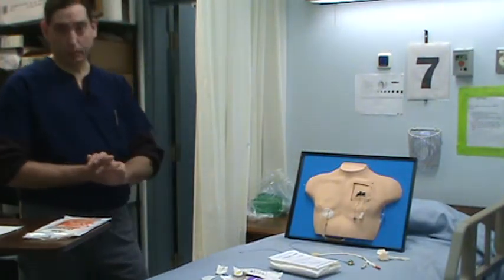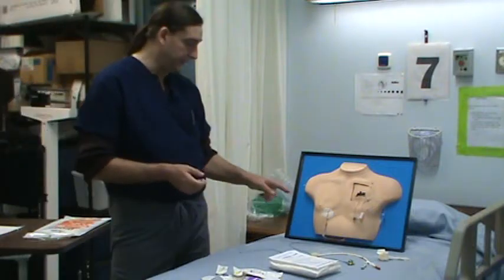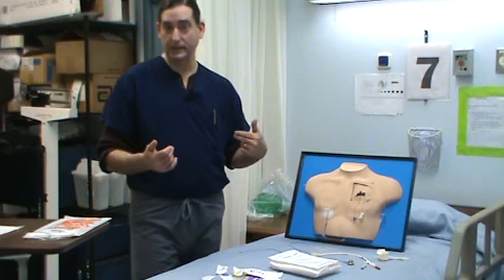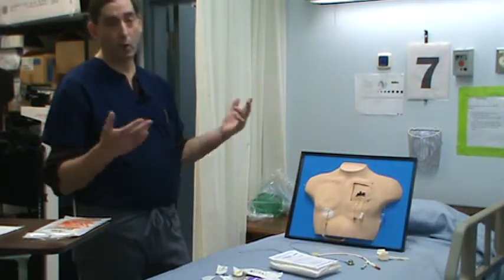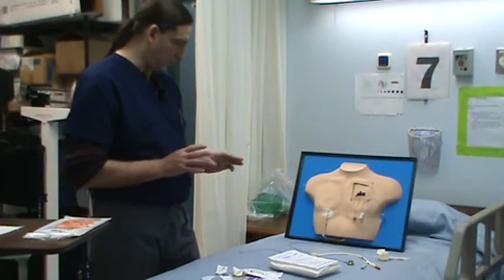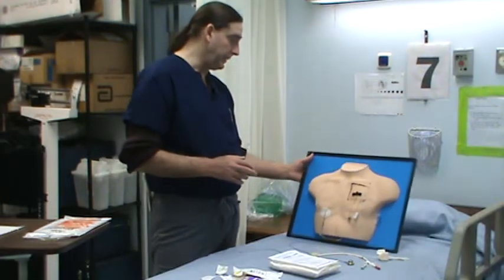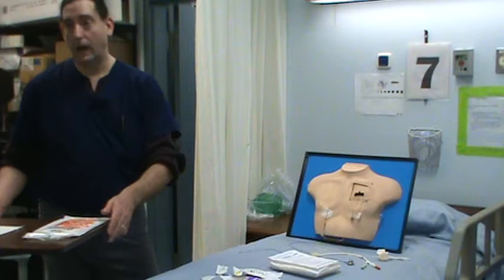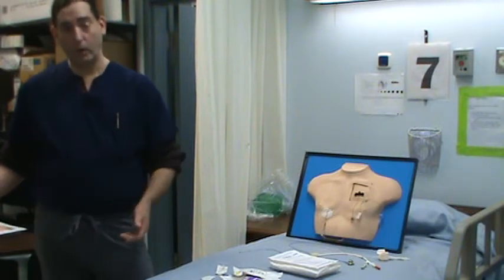This is a sterile procedure. You do not want to get a central line infection. They can go septic, because that's infection right in the blood and it can travel all through the body. So this is a sterile procedure. Now my patient's going to be alert and oriented. If they're not, then we've got a problem. I'm going to have helpers in here or whatever.